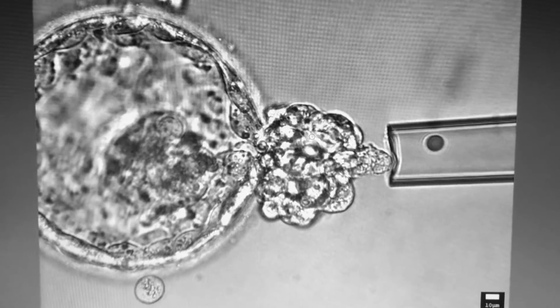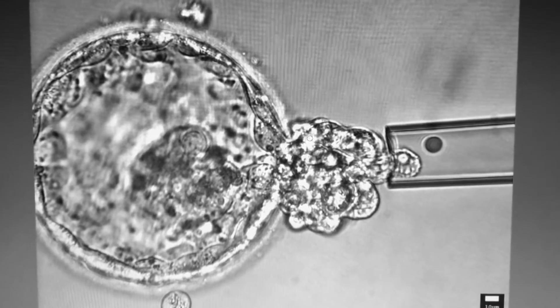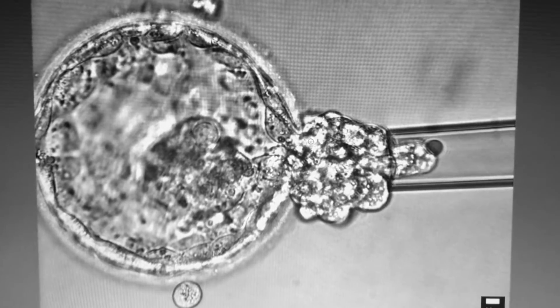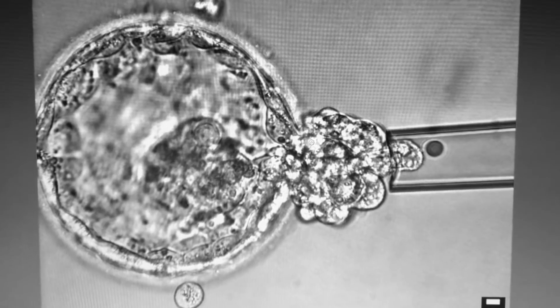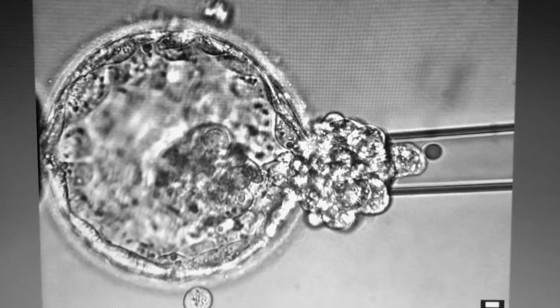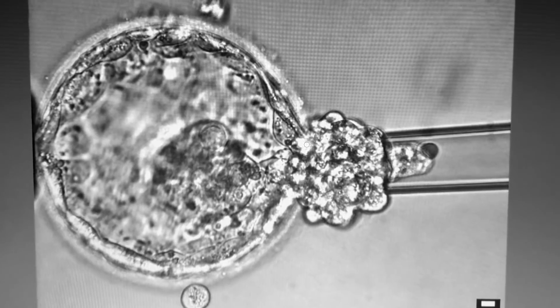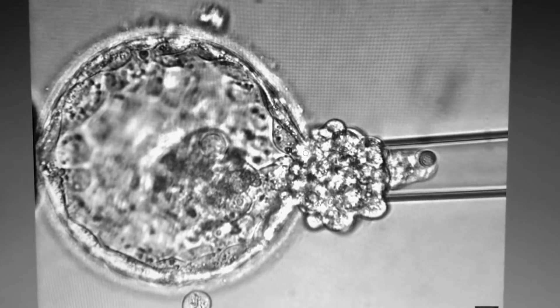You can see that with the help of a special pipette, the cells are first aspirated using adequate pressure. Following the aspiration, the laser is applied so that the cells can be broken free from the trophectoderm of the embryo.